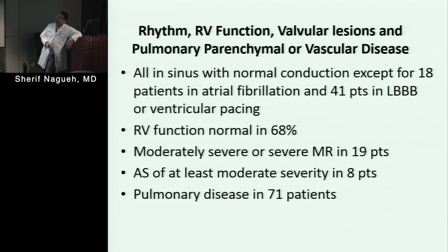Okay. So an ASD could come in, a VSD could come in, but we didn't have any cases like these. The problem is when you start throwing in left bundle branch block, I know they're not allowed, but they are, 41. When you start throwing in curves that you know in this population don't work well, you can neither generalize to the total population, nor identify it in individuals.